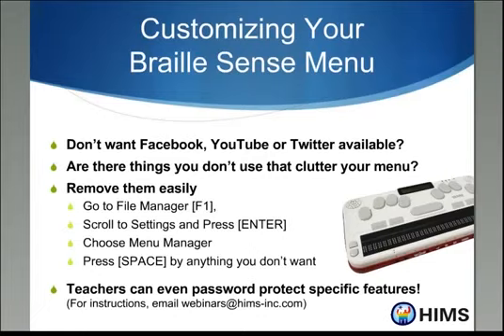This is also really good for standardized testing. One of the things that you can lock out are things like the spell check, so that you may just want the student to be able to get into a word processing document, not be able to get to the web to look up answers, not be able to get to email so they can't email their friends. Not that your students would do such things, but someone might somewhere.